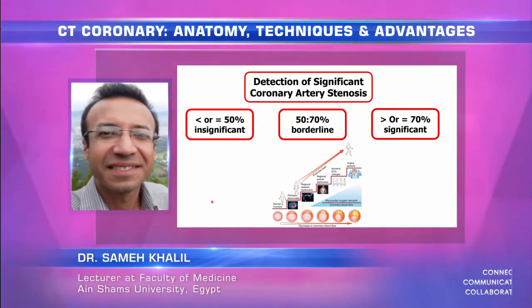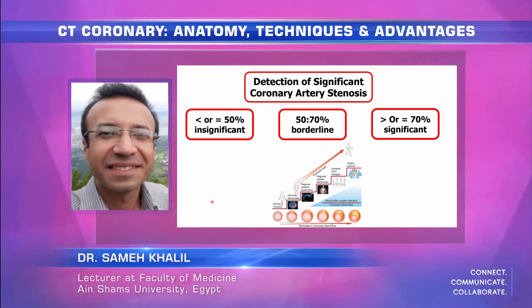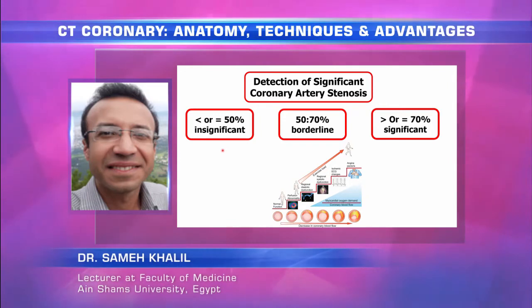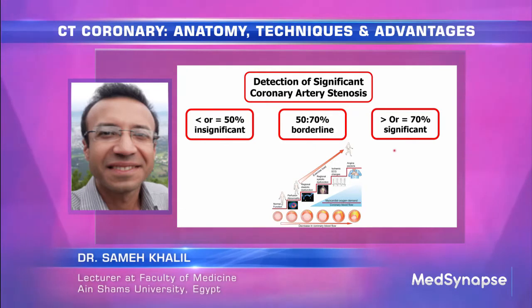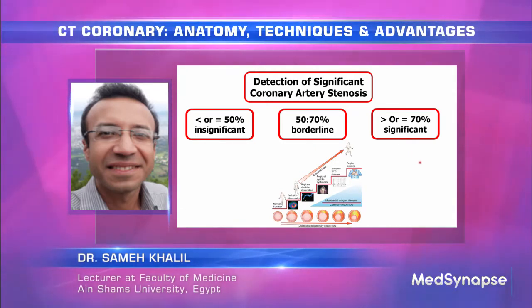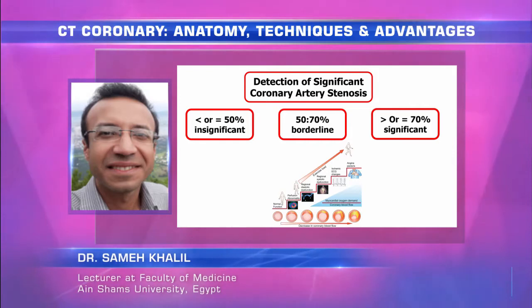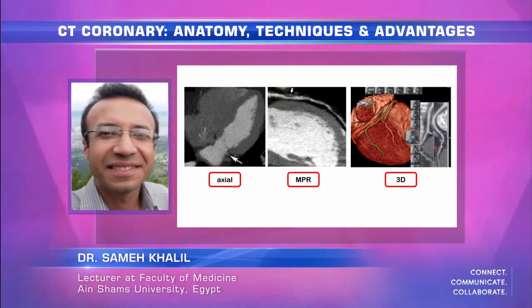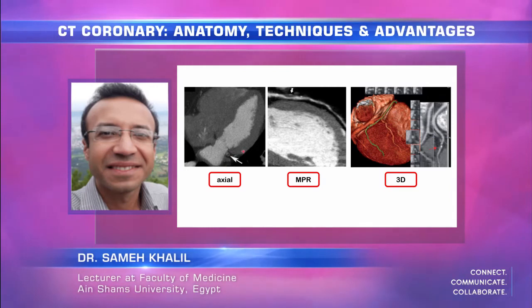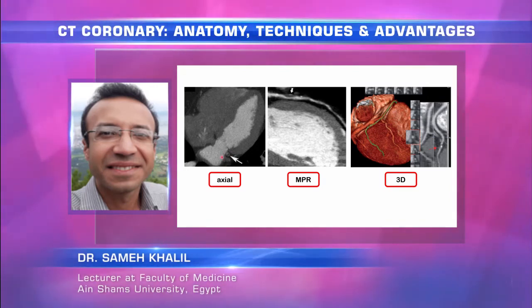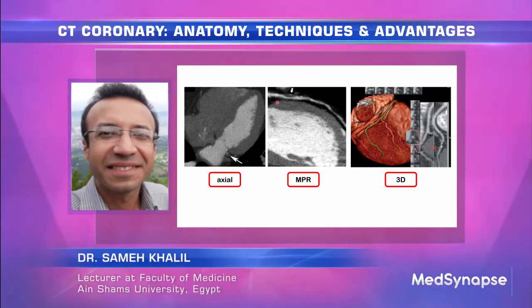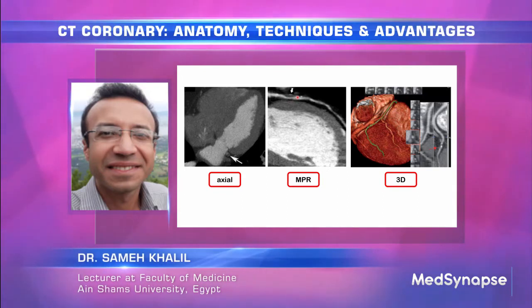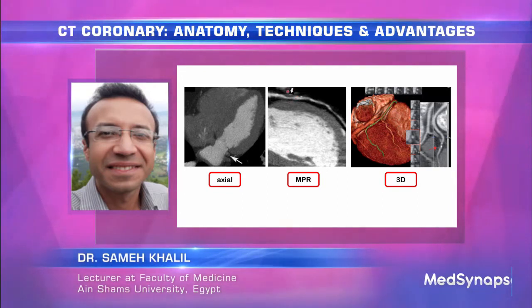Regarding plaque significance — similar to carotid circulation — plaques below 50% are insignificant, plaques from 50–70% are borderline, and plaques beyond 70% are significant. This shows an axial view of a totally occlusive plaque and a multi-planar reformat of a significant mixed plaque, where we can see soft material, fat, fibrous tissue, and a calcified dot.